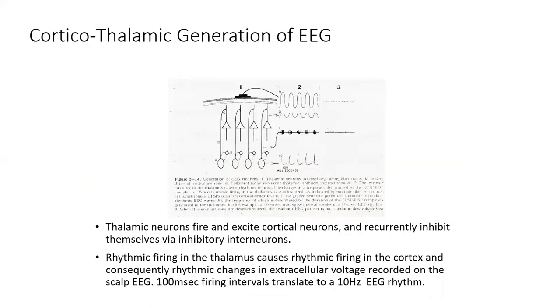Okay. So there are certainly rhythmic generators of what we see on the EEG, and this is really the oscillation between excitatory and inhibitory postsynaptic potentials. And this is inherently due to a few different things. Intrinsic membrane properties themselves, neuronal synaptic potentials, and then thalamocortical connections themselves.